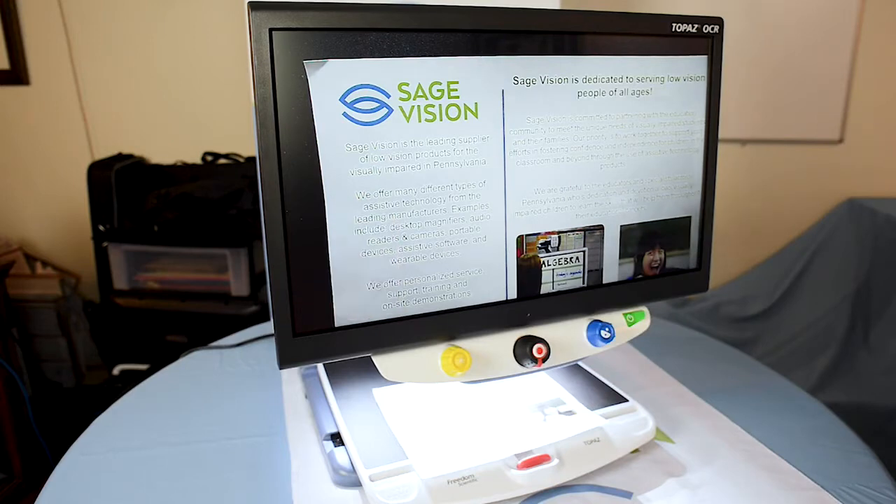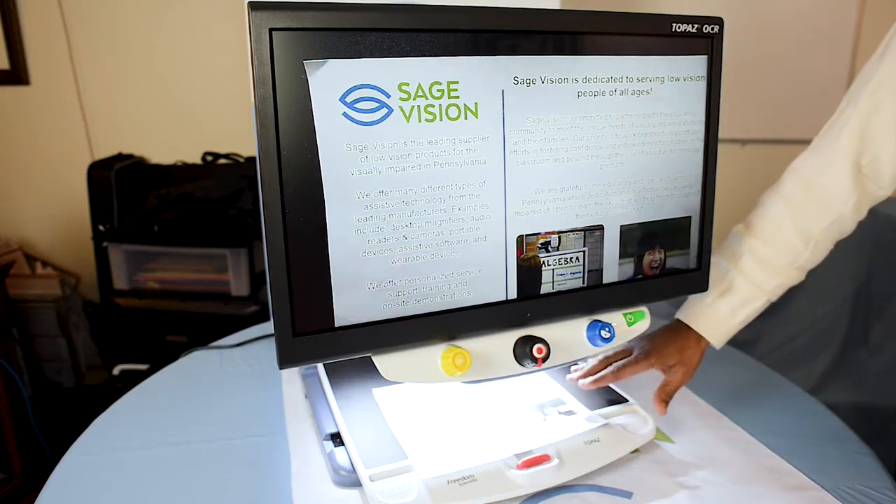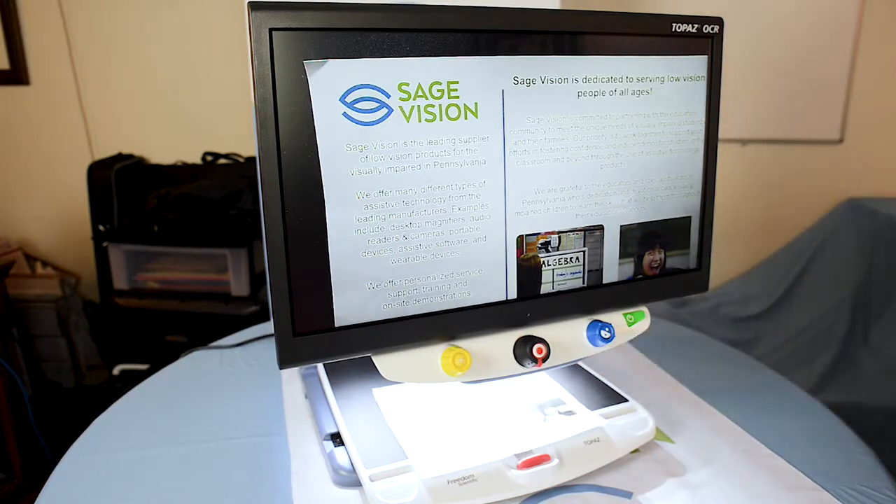This is great for if you're reading or writing, looking at your mail, reading the newspaper, menus — any sort of thing that you're trying to read that needs to be magnified. It's great for that.